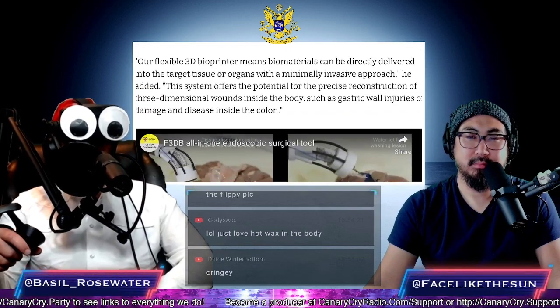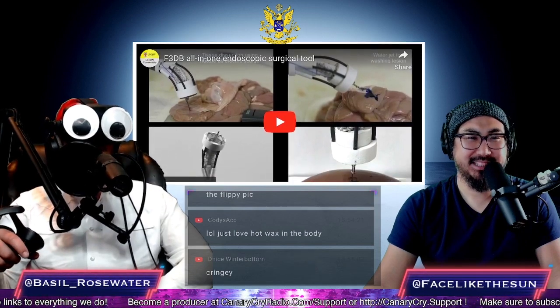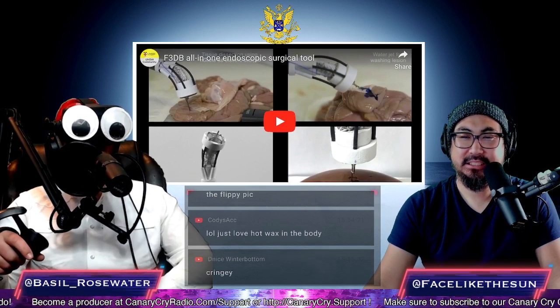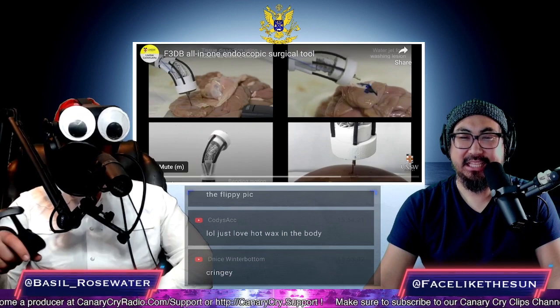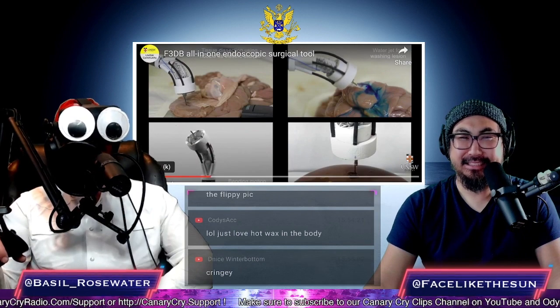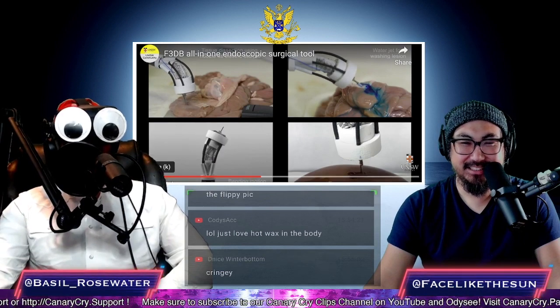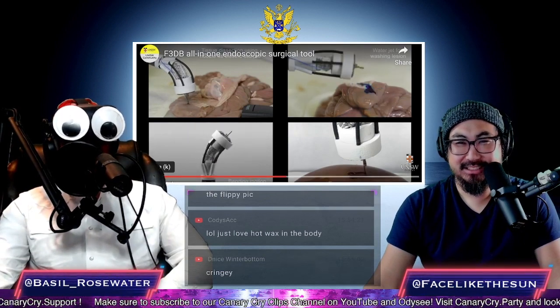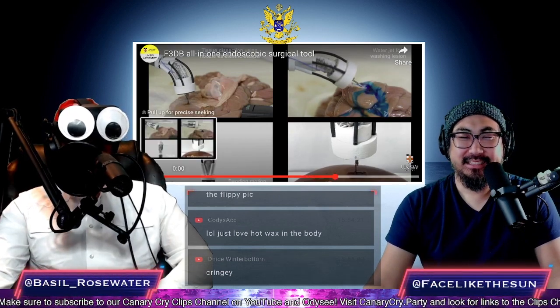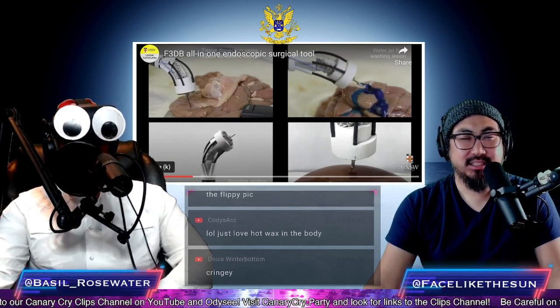Quote, our flexible 3D bioprinter means biomaterials can be directly delivered into the target tissue or organs with a minimally invasive approach, he added. Quote, this system offers the potential for the precise reconstruction of three-dimensional wounds inside the body, such as gastric wall injuries or damage and disease inside the colon. Oh, so when they say endoscopy, they really mean endoscopy. We're talking gastric wall injuries. We're talking damage and disease inside the colon.